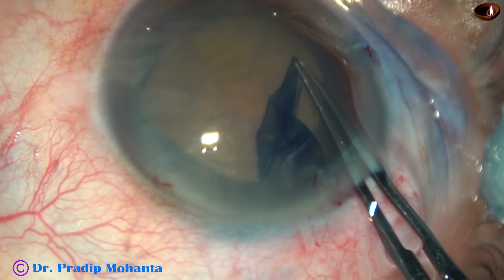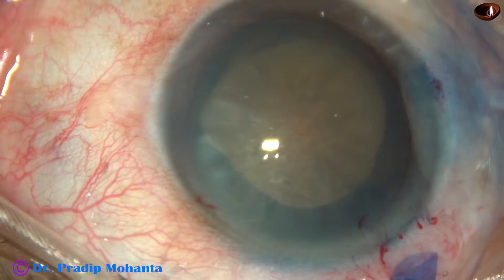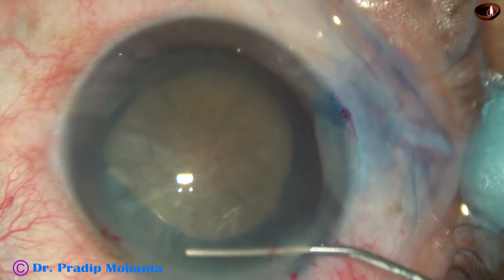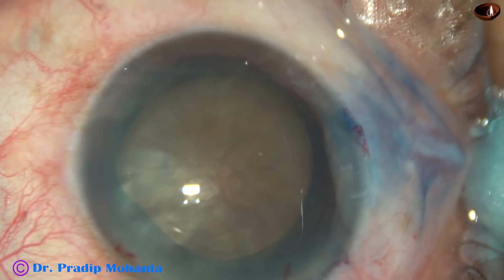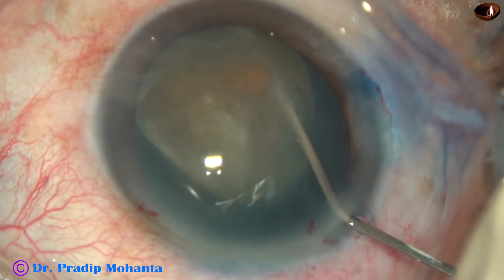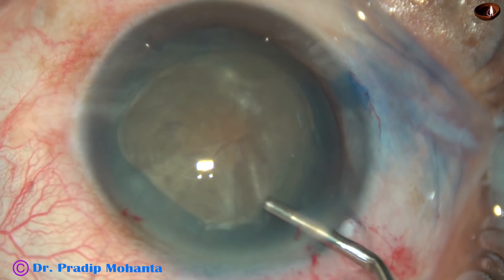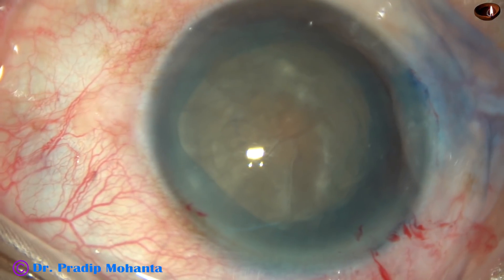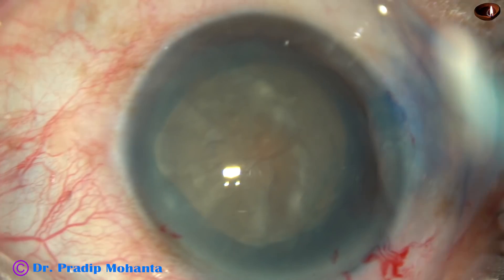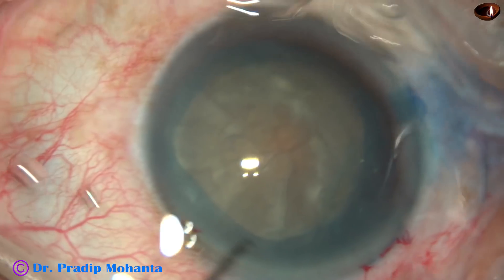By smart pulse, I could bring it on track and complete the CCC. So, if there is convexity of the anterior surface — more convexity than usual — it is always better to do two-stage rhexis. In this case, had I done a single-stage rhexis, the rhexis would have been totally different.